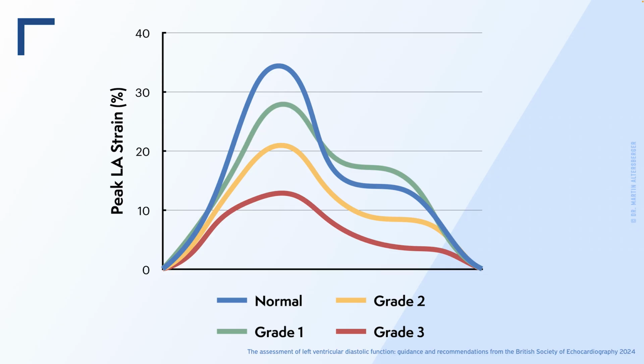The contraction strain is also something which can be used for grading diastolic dysfunction and filling pressures. The lower it gets, the more likely elevated filling pressures are. Also keep in mind you need a good left atrial filling to also have a good atrial contraction.